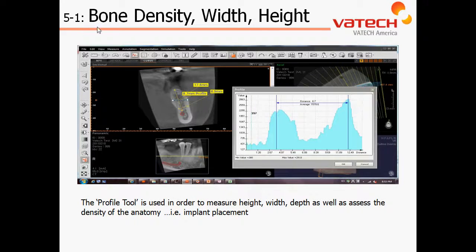Chapter 5, Section 1: Assessing Bone Density as well as Measurement of Width and Height of Bone. In this video session, we're going to utilize two icons — our length measurement icon as well as our profile icon — which will assess the bone quality of where we're going to place our virtual implant.